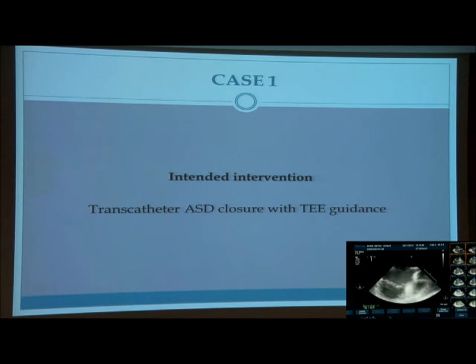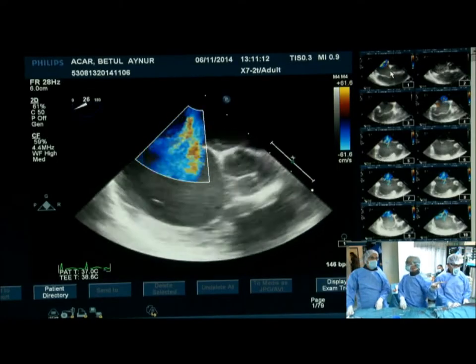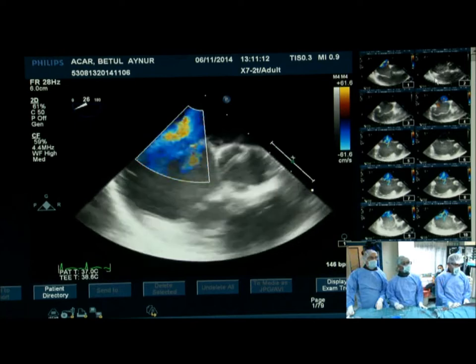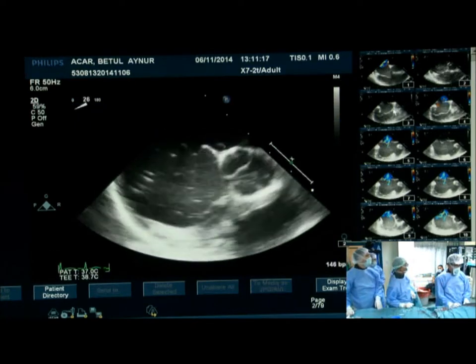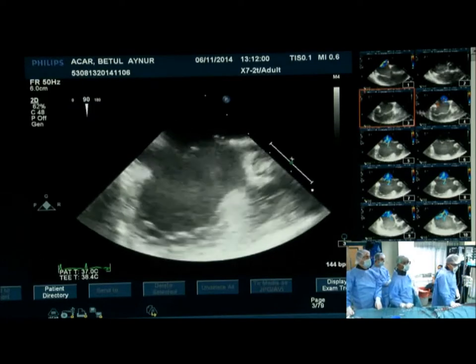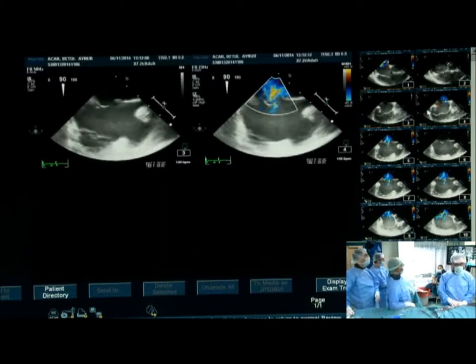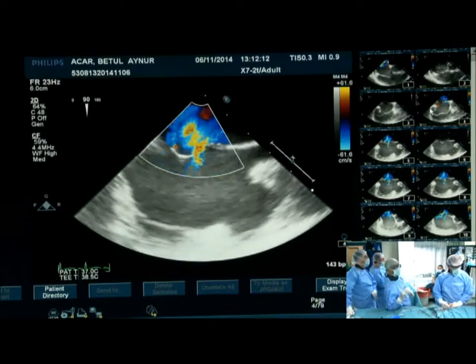Okay. So what can you see at the moment then? You've got the details from the slides. We still see the slide. Okay. Are we able to show you the TOE at the moment? Can we show the echo? So do you see the TOE? Yes, we see the TOE. Okay. It's not real time because this was recorded a little bit earlier, but what we see at the moment is let's one view at a time, yeah?